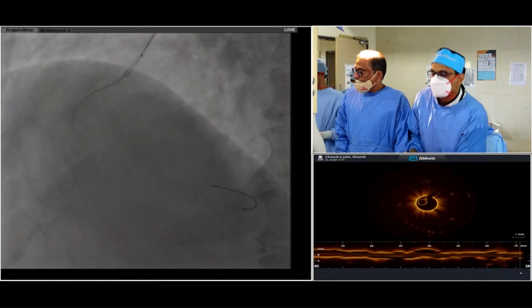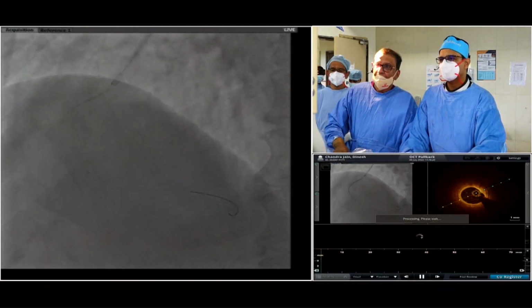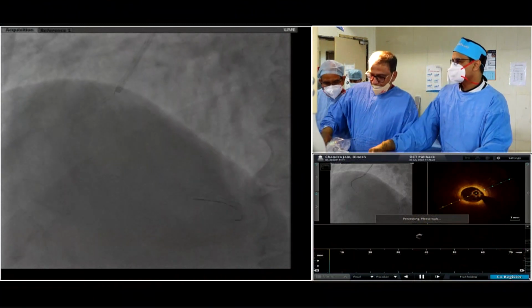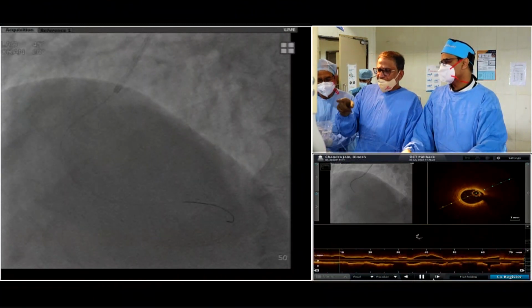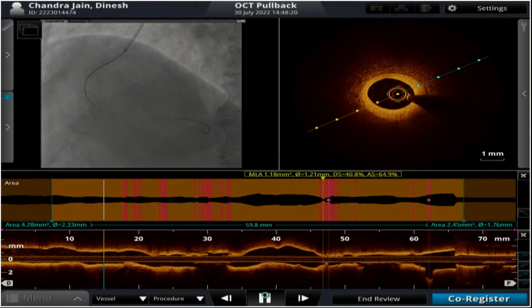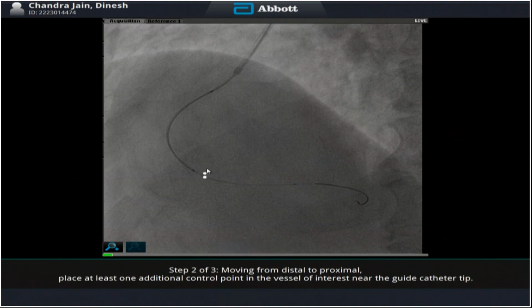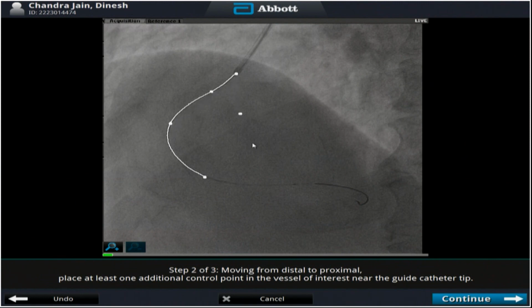Stop. This time you see the image. I've just injected normal saline. No alcohol. Can you show the OCT? Let's get this out. Let's give another 2,500 heparin.